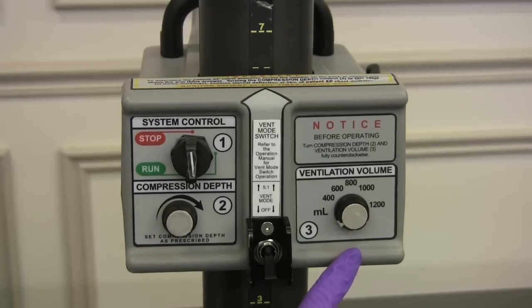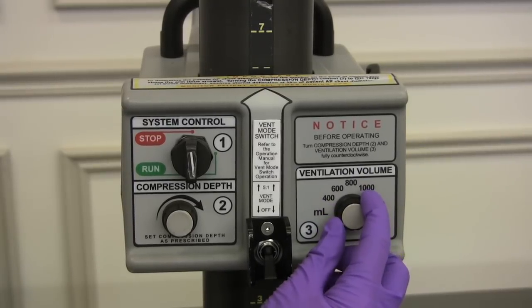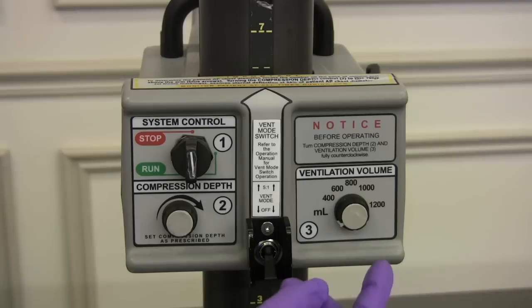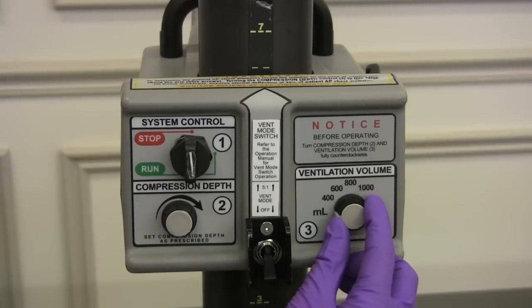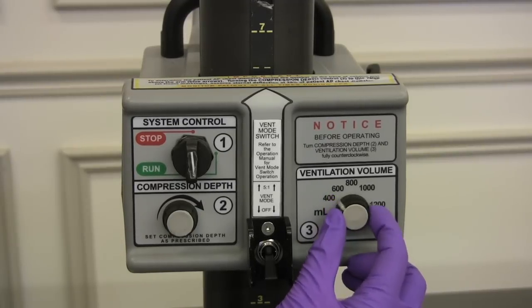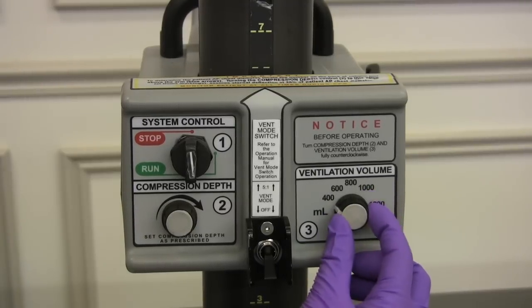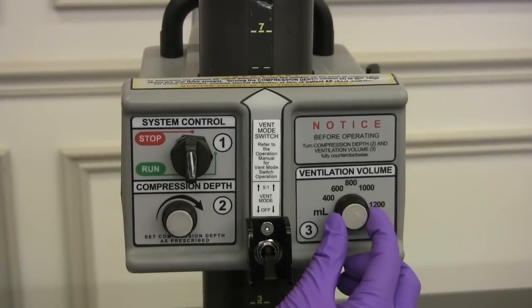Over here is our ventilation volume. This is a rotational control used to control the volume in milliliters of oxygen that is delivered by the thumper ventilator to the patient. The tidal volume is increased with a clockwise rotation and decreased with a counterclockwise rotation. Make sure once again that this is all the way in the off position.